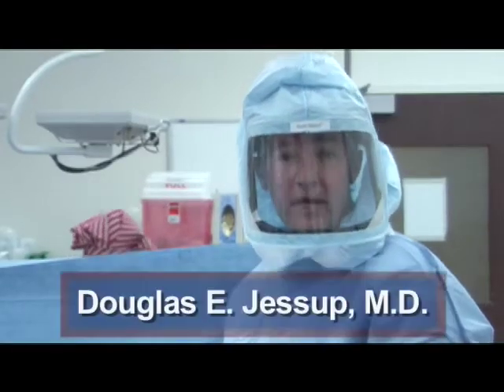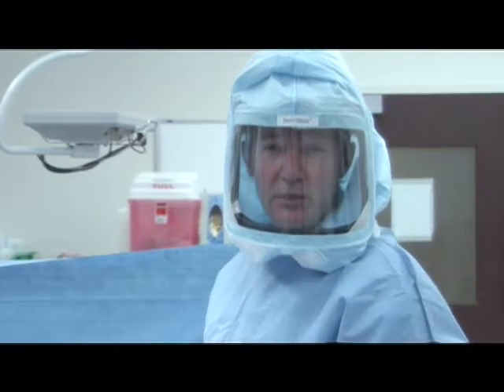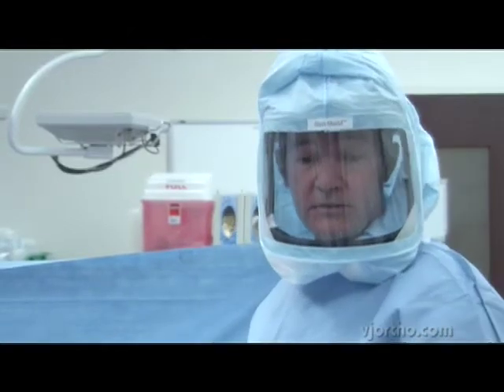This is a 78-year-old woman with five years of increasing knee pain. She's really quite impaired by her symptoms at this point. She's tried NSAIDs, injections, physical therapy — not getting anywhere. Symptoms have progressed to the point that we have to go ahead and fix her knee.